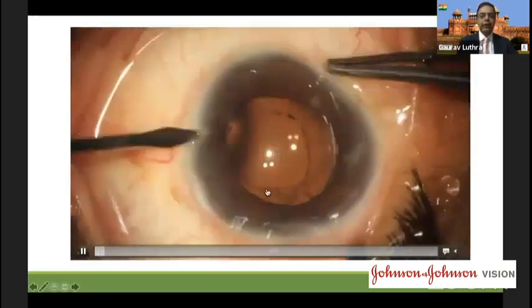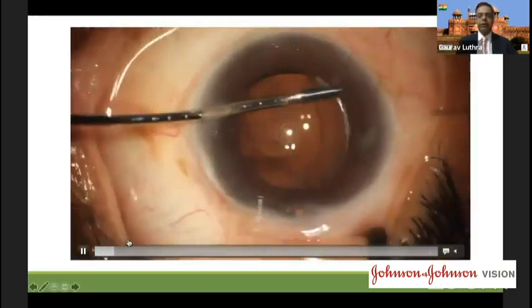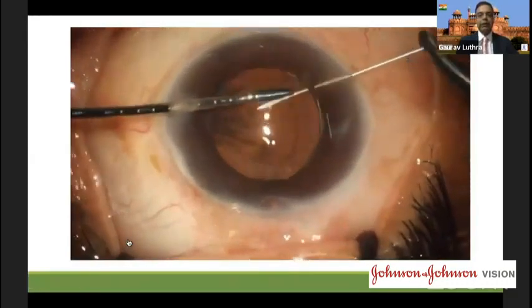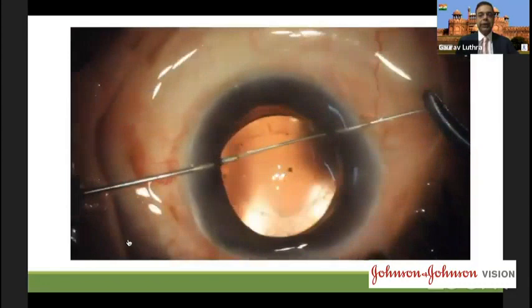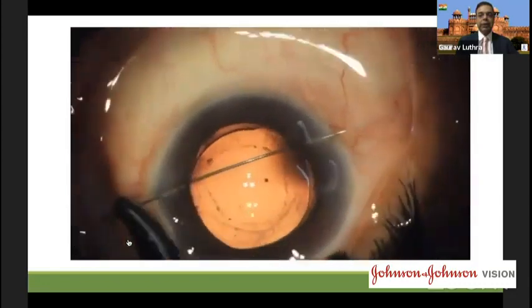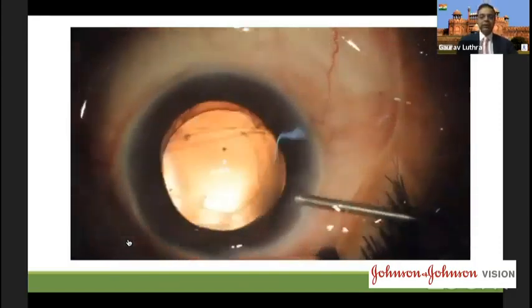This was another situation where we were having a traumatic mydriasis again, and I'll run faster now because you've already seen one of the videos. So here we're going in with a 26 gauge needle, holding the iris with the forceps, and then the second pass with a 26 gauge needle, railroading in and passing the 26 gauge out, and then pulling a loop out as we showed in the first one. But here we'll be doing things a little differently.